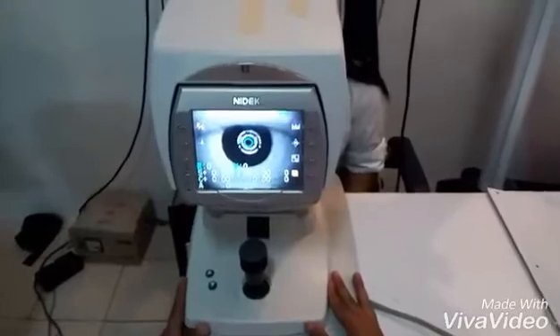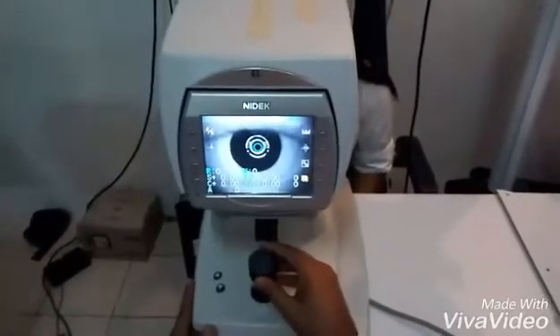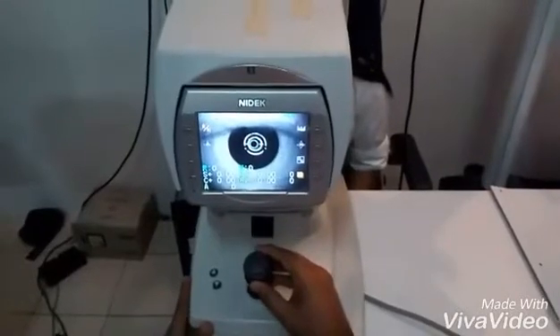Once the image is focused, the examiner with the same joystick will adjust until a yellow circle is shown and the readings appear.